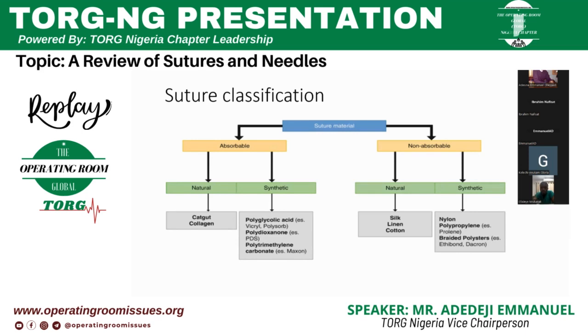So from the diagram you can see on your screen, it's just for us to have an idea of what I'm talking about. The overview of the classification of sutures: we have the general classification of absorbable and non-absorbable. Then under the absorbable, we have the naturally occurring and the synthetic sutures.